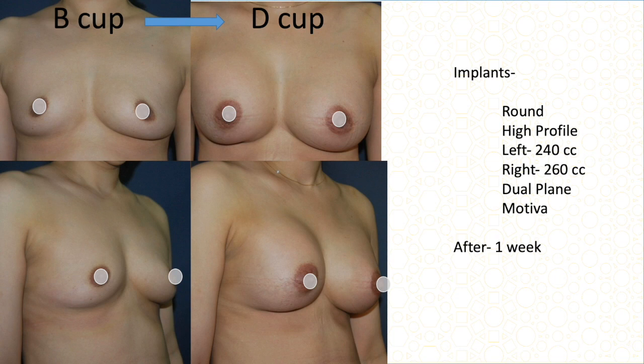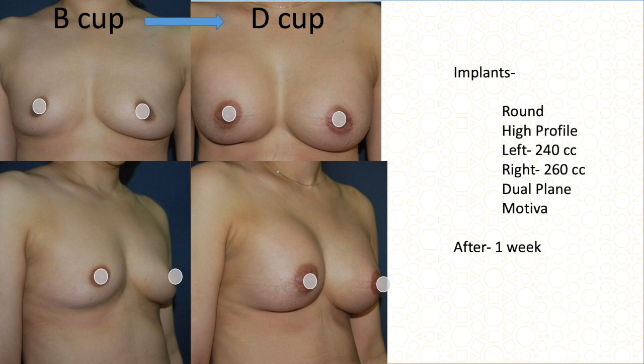This is another B cup patient with visibly different breast sizes — the left side is bigger than the right, with some sagging on the right. We decided to use different-size implants to correct this. On the left side, because it was already bigger, I used only 240 cc. On the right side I used 260 cc with higher profile in dual plane using Motiva. This was the result after one week.